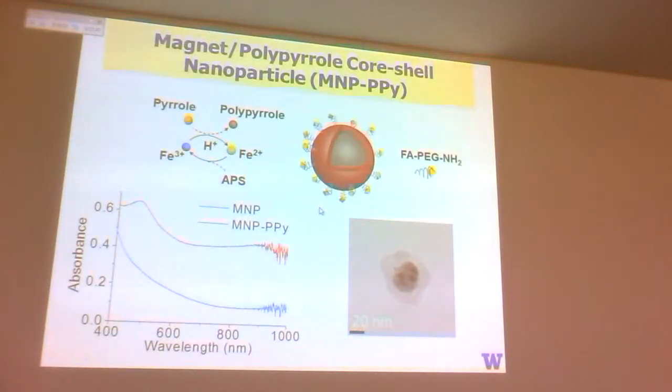Okay, so let's go to the first one, which was a coupled particle system. These are types of particles which were originally developed for multifunctional imaging. So if you want to do MRI and optical imaging, or MRI and photoacoustic imaging, okay? Or CT and MRI, in the nano world a lot of groups have come into designing these multifunctional agents. So one agent we worked on with colleagues of ours in Seattle was designed to have a magnetic core, which is often used for contrast in MRI systems, okay? But it is encapsulated in a shell.